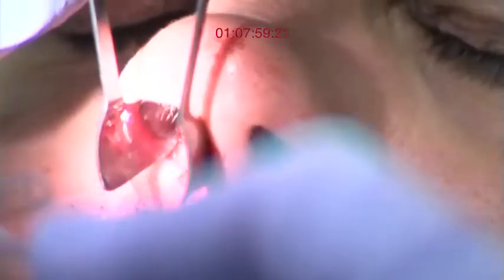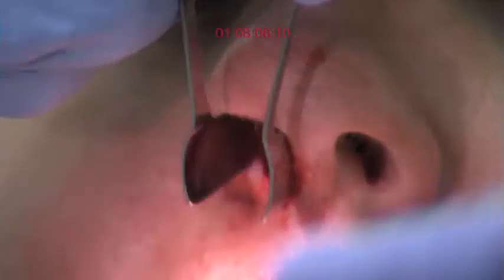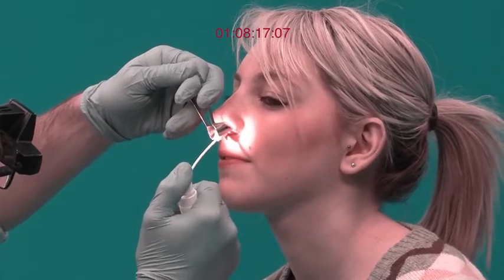Use the suction to remove any blood clot from the nose. If the blood clot is deeper within the nasal cavity, then a smaller suction end will be required. Spray the nose with the co-phenylcaine spray. This spray not only gives local anaesthesia, but the decongestant causes the nasal lining to shrink, allowing a better view of the nasal cavity.